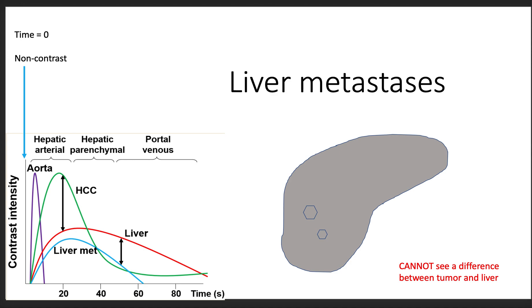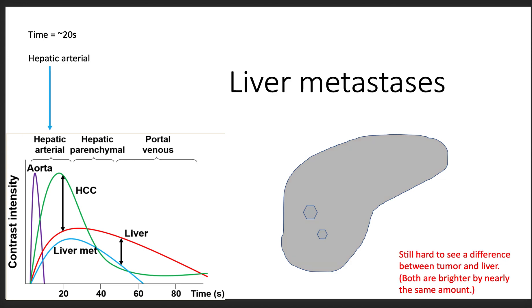Then we get into the arterial phase. The liver is getting a little brighter, and the liver metastases are getting a little brighter as well. But you can see it's still hard to tell the difference too much between them, because both got brighter by a pretty similar amount.